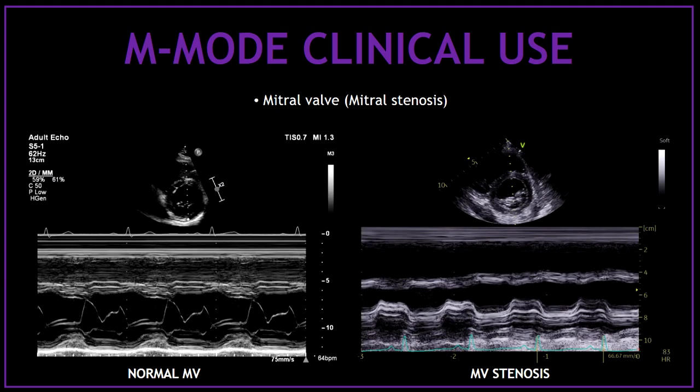Another clinical use of the M-mode is to assess the mitral valve. By placing the M-mode across the mitral valve leaflets on the parasternal short axis view, you can visualize the leaflet motion. Thanks to the high temporal and axial resolution, we can assess the leaflets' motion in order to diagnose mitral stenosis, for example. On the left, we can see a picture of a mitral valve with normal leaflet motion, and on the right side, we have a mitral valve with stenosis.